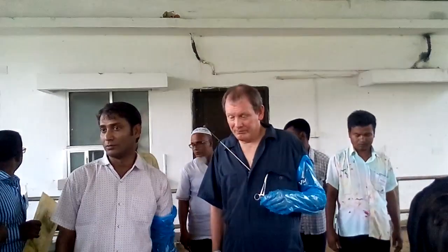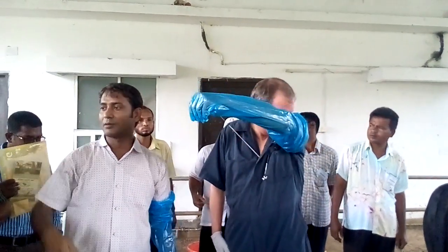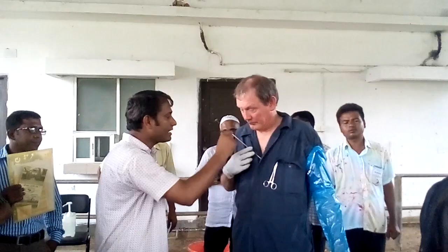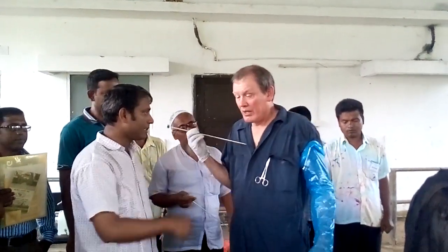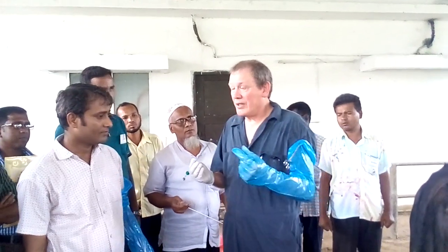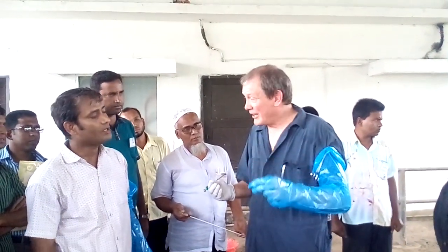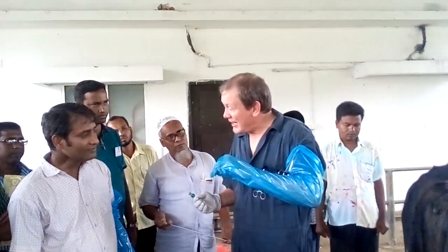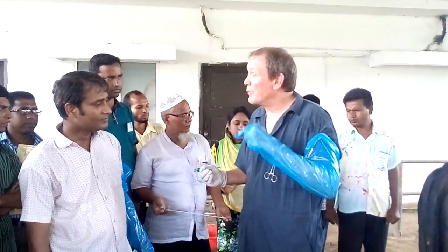You will push this gun within the body after you have semen inside. The semen would be taken from the nitrogen tank and thawed properly. We cut off the end, we put the gun, we put the sheath. My focus today is not on the preparation of the gun and the semen and thawing — we will do that tomorrow.